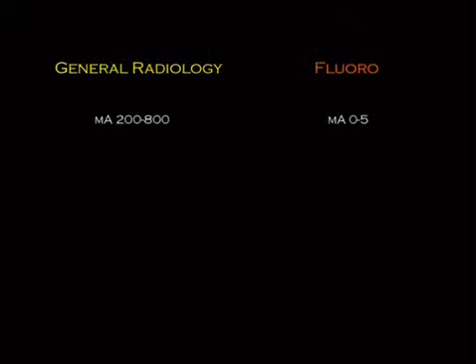Additionally, the images are still performed at a normal KVP, and that is because you still want your regular image contrast. You're not doing mammo. You don't need to use high or very low energy levels.